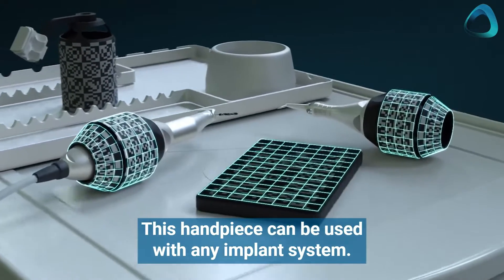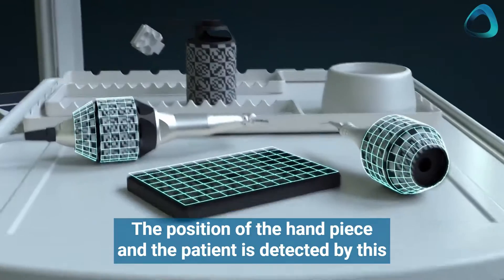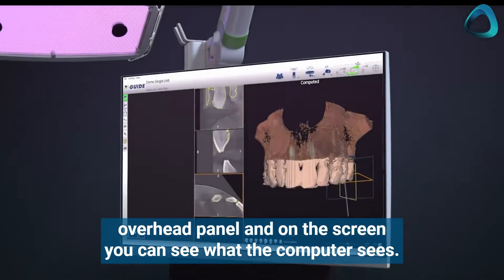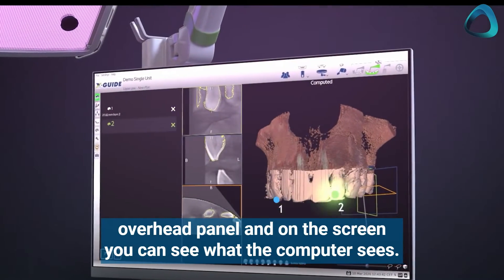This handpiece can be used with any implant system. The position of the handpiece and the patient is detected by an overhead panel, and on the screen you can see what the computer sees.